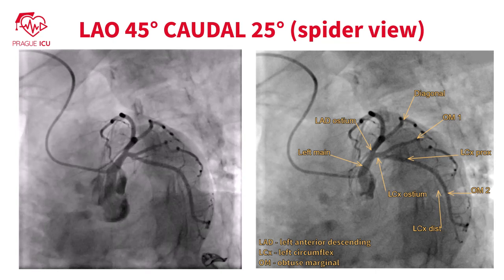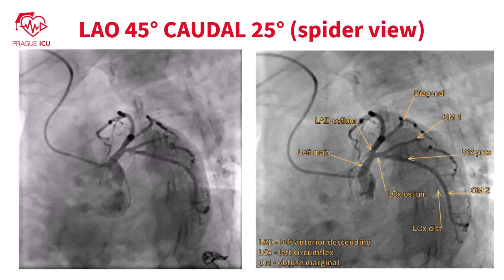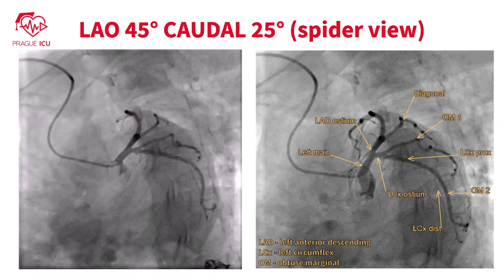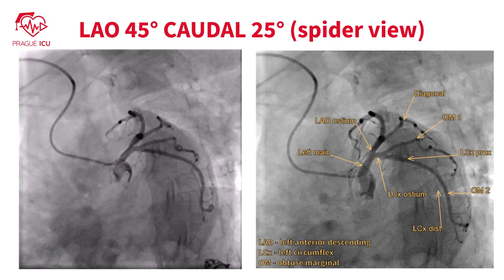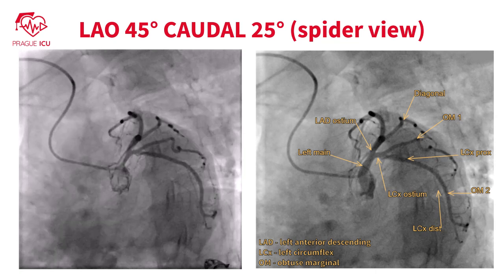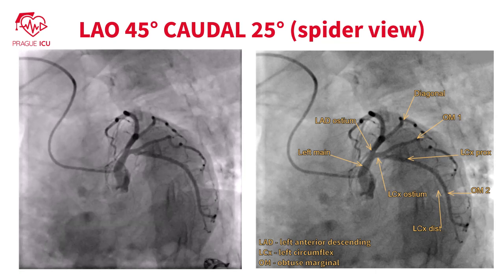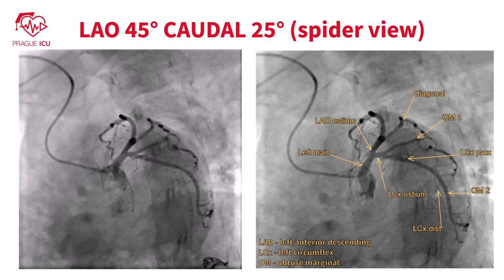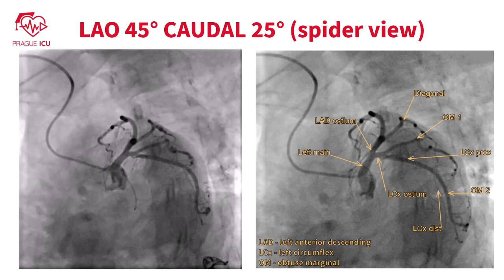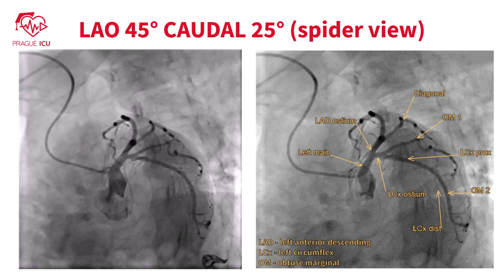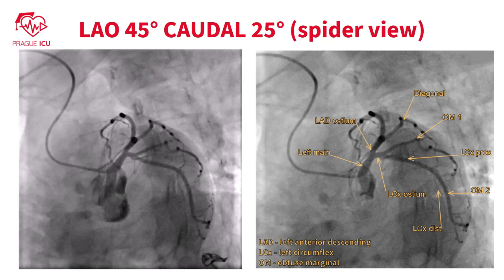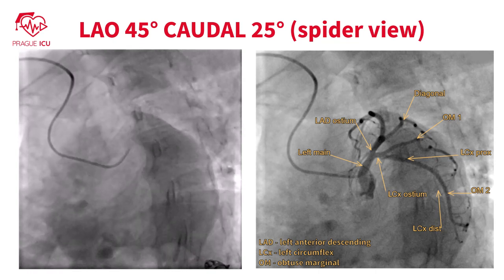The view is not good for visualizing the distal parts of the left system and foreshortens the coronary branches. Yet this view is useful during coronary angioplasty to check whether a stent placed in the proximal LAD is impinging on the left main or likely to pinch the ostium of the left circumflex.